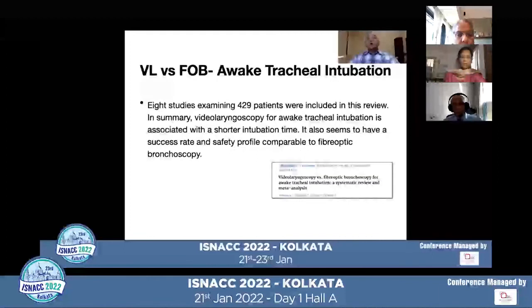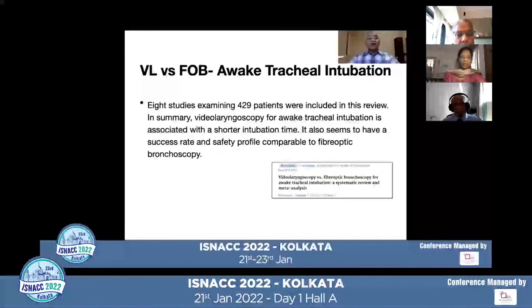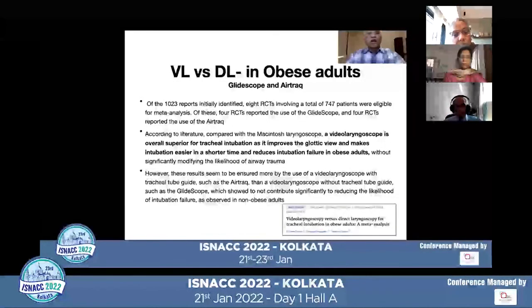For awake tracheal intubations, 8 studies including 429 patients were included. Video laryngoscopy for awake tracheal intubation is associated with shorter intubation time. It seems to have a success rate and safety profile comparable to fiber optic bronchoscopy. In obese patients, 1023 reports were initially identified, and 8 RCTs involving 747 patients were eligible. Video laryngoscopy was overall superior for tracheal intubation as it improves glottic view, makes intubation easier, shortens intubation time and reduces intubation failure in obese patients.